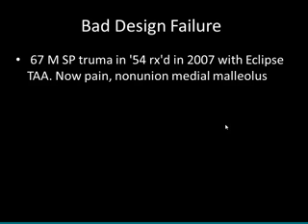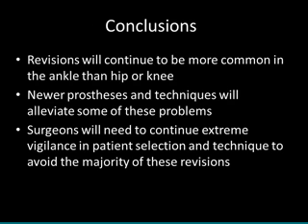Now, here was an ankle that was approved for release in the United States called the Eclipse ankle. This is a 67-year-old male.